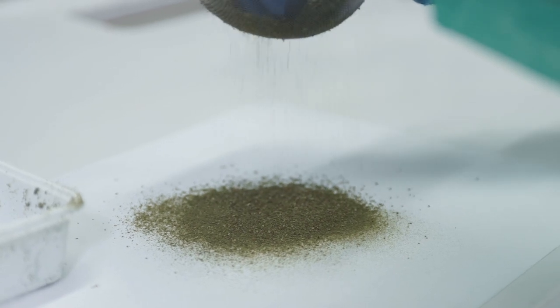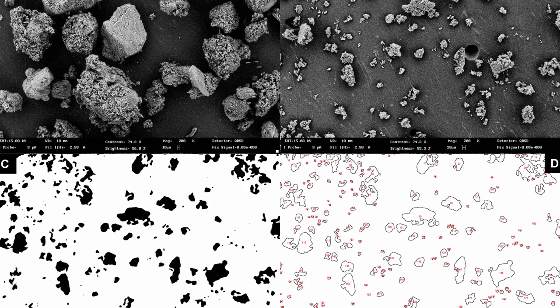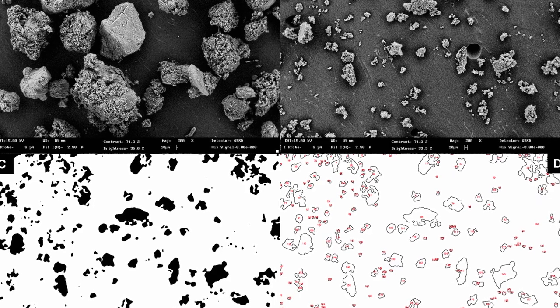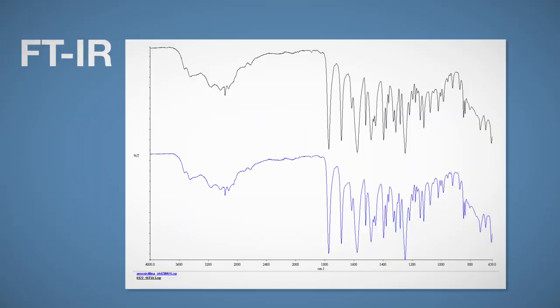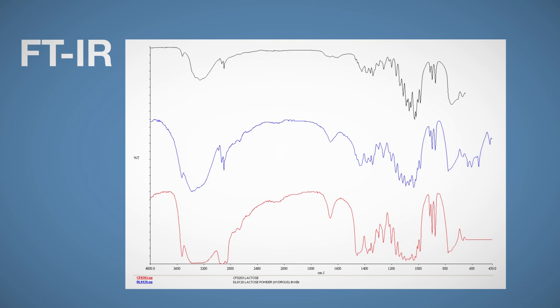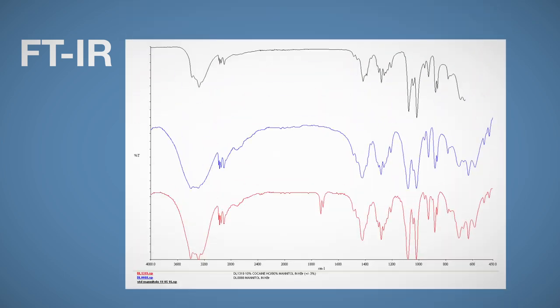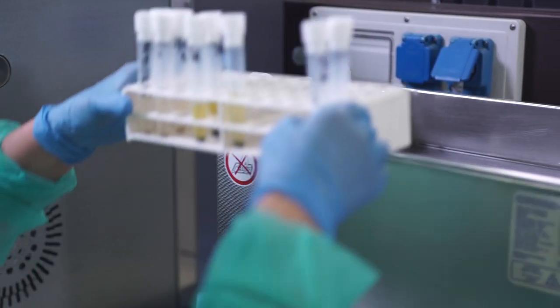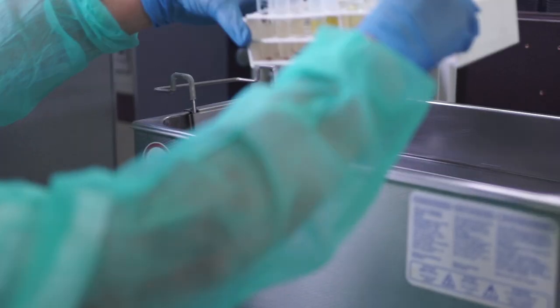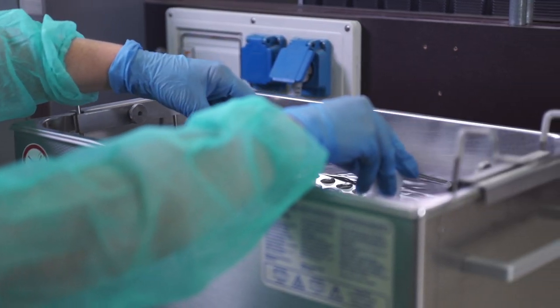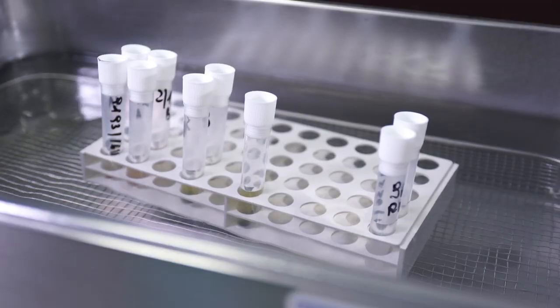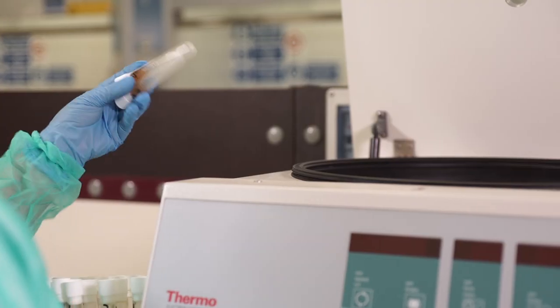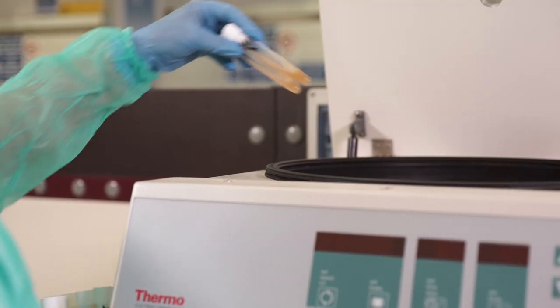A representative sample is crushed and pulverized into fine-grained particles to reduce sampling uncertainty. Preliminary colorimetric assays or FTIR spectroscopy are used to check for adulterants and diluents. Samples are then extracted using solid-liquid extraction. Liquid-liquid extraction is mainly used in the case of heroin, amphetamines, cocaine, and methadone solutions.